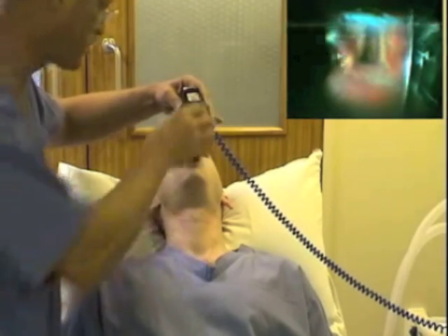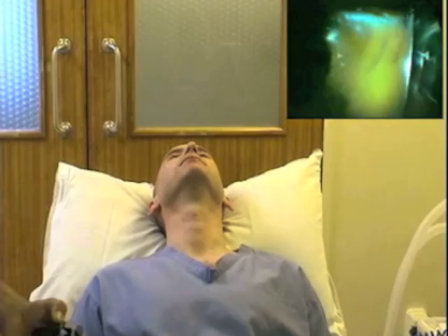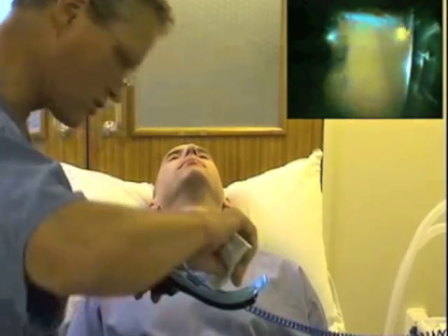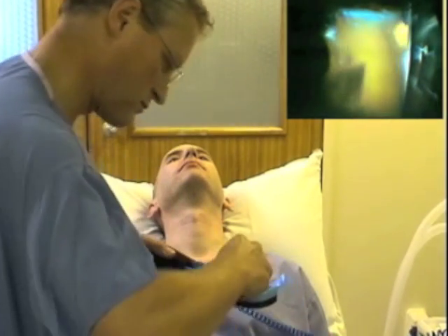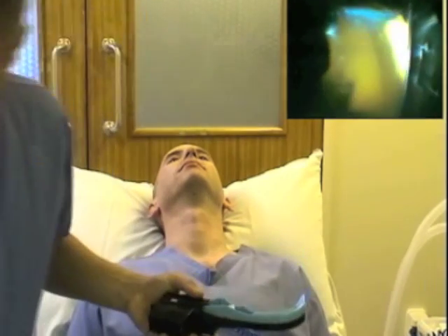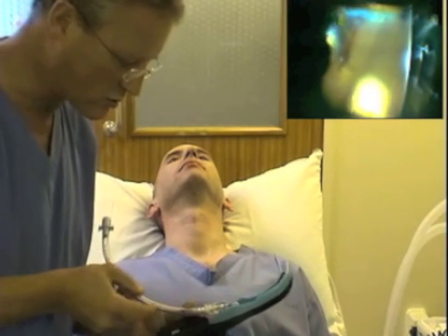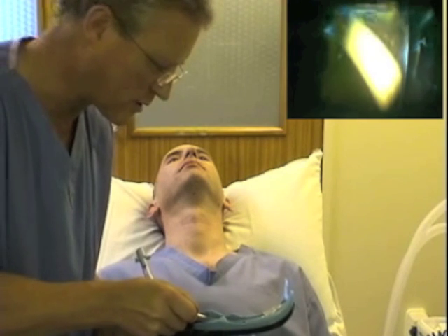I'll just take the scope out below the tube — you've got a perfect view of the larynx. Just take the tube — it's been well lubricated. You need to lubricate the channel of the Airtrack. I've already done my system. Then just pass your tube down the Airtrack — the tip is just at the end, don't pass it any further.